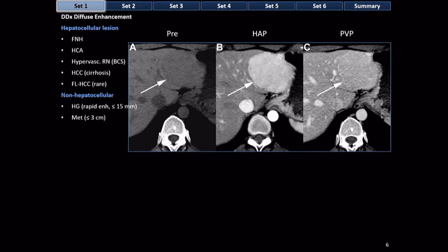Hemangiomas up to about 15 millimeters can enhance homogeneously. Once bigger than 15 millimeters, they very rarely enhance homogeneously. Metastases up to three centimeters, if of hypervascular origin, can be homogeneous. But no self-respecting metastasis bigger than three centimeters will be homogeneous, because any such metastasis will develop internal ischemia or necrosis.